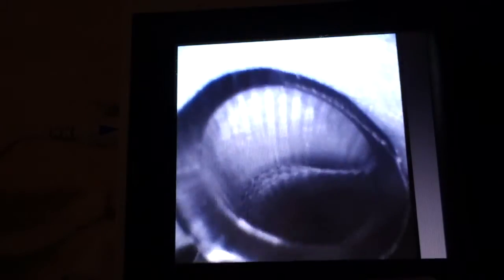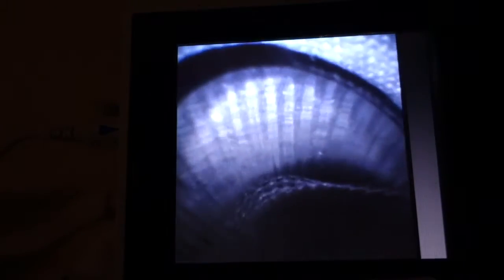And that's the limit of dexterity in that position. Then you can back out and choose a more difficult target. As usual, always keep anatomy you want to see in the middle of the screen and go slowly. I'll go to the highest target. Once I've been satisfied that I've entered with a fibroscope tip, then I'm going to back out. You can keep picking targets for a while, whatever you'd like. For the sake of time, I'm going to back out quite a ways and back out into the fake bronchus area, and then I'm going to pick the other side.